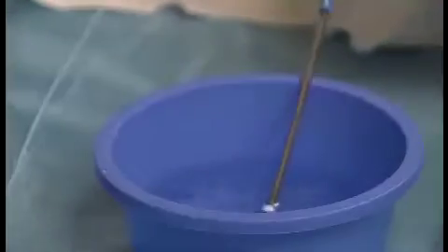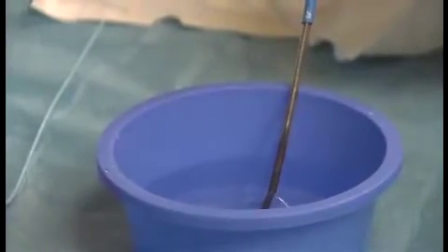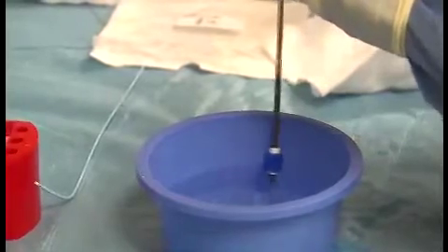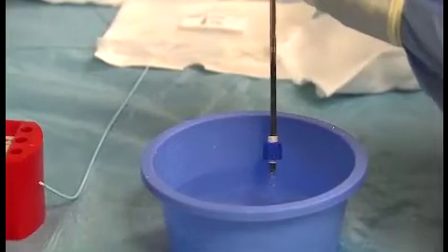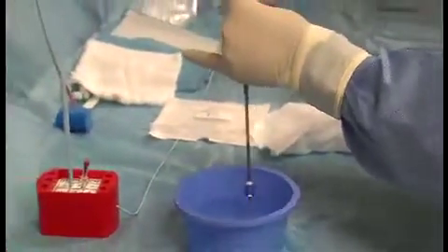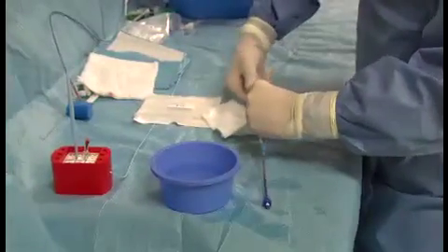While they are loading the device, I'm introducing the long sheath, which is not very interesting to see. I think, Mario, one of the most important steps of this procedure going to the left side is actually the entry to the left atrium with the sheath. So if we can ask the director just to put the fluoro on, we'll see, Mario, how. Okay. Well, this may be an important point. So let's go back to fluoro.